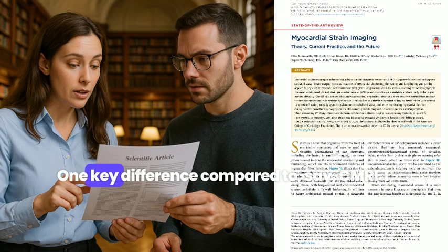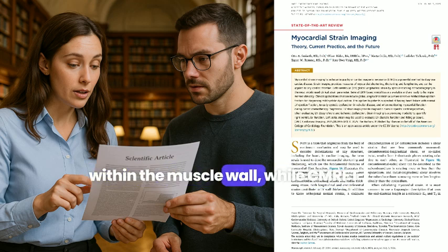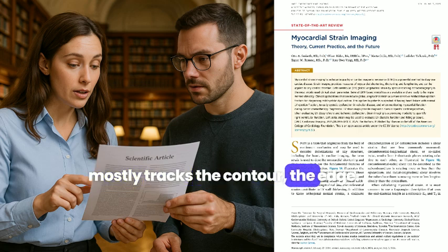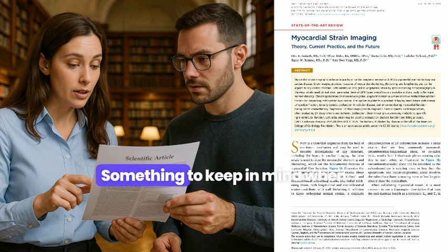Ah, okay. One key difference compared to, say, CMR-FT is that STE tracks these speckles within the muscle wall, while CMR-FT mostly tracks the contour, the edge. So that could lead to slightly different numbers. It can, yeah. Something to keep in mind when comparing studies or modalities.